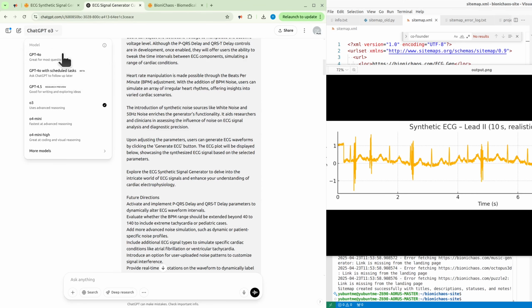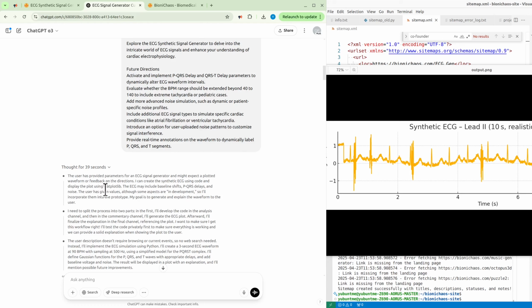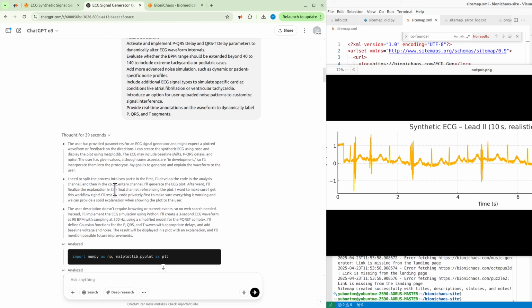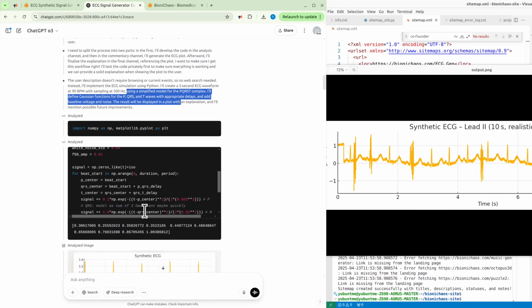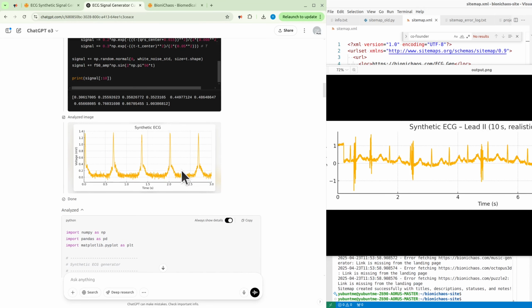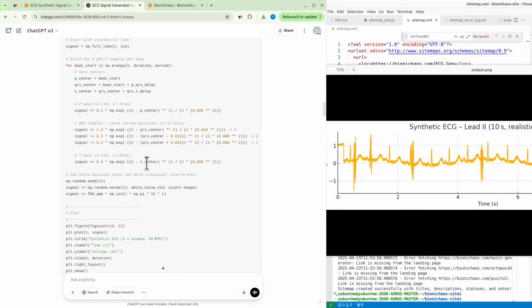Now we gave it to o3, so we now have new AI code generating, or reasoning, whatever they call the large language models. They're now multimodal as well, so they can do code, images, video, and the likes. So o3 is a reasoning model, and this is what it said when we shared the description of what the older version of the ECG synthetic signal generator does. It reasoned for a whopping 39 seconds, which is in machine time forever, and it came up with a plan. It generated Python code and actually executed it on the cloud, on its own server. It generated this synthetic ECG, which obviously has quite a few issues with it, as you can tell. Not sure if you're familiar with ECG or not, but if you just look up a regular ECG.